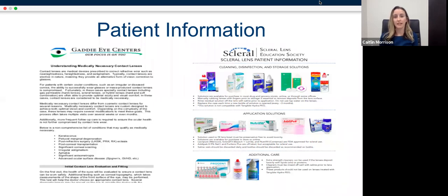One of the great tips that I had was that Boston Advance is a fabulous solution to clean the lenses when they come from the lab in your fitting sets. The way that they're packaged and shipped to you, when you put them on the person's eye, you might get a wetting problem on the front. So if you can just rub them with Boston Advance right when you get them, that'll save you a lot of time and headache, and you can over refract a lot better.